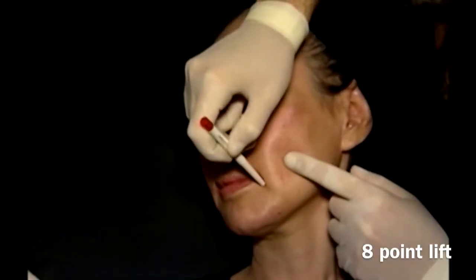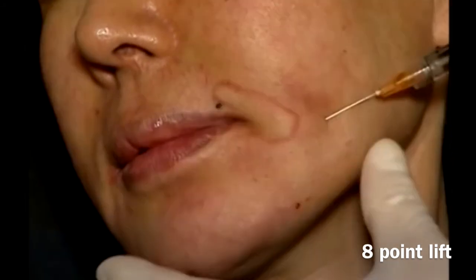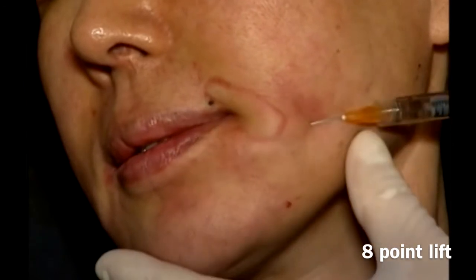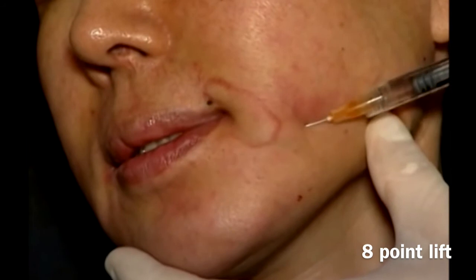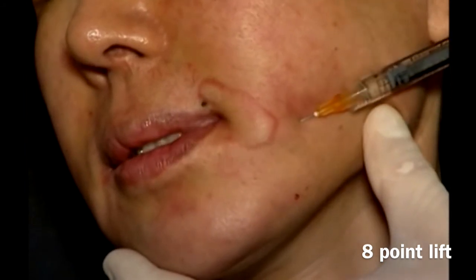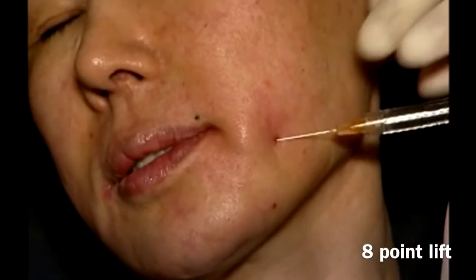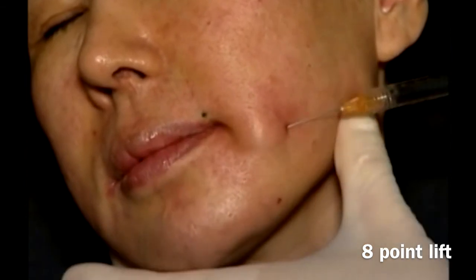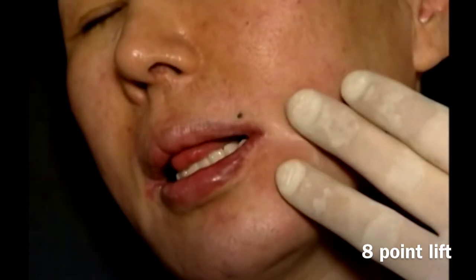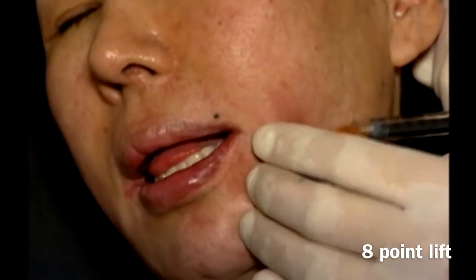Do the very same on the left side. Start by marking the no-go area, inject Voluma with the 25-gauge cannula, retrograde and anterograde to compensate the volume loss and the retruded lower maxilla. By replacing volume at this level, we get a better anterior projection. Change to Juvederm Ultra Plus, because now we are heading to the lower lip. The importance of this strategy is to strengthen the modiolus area, so that there is an improvement and upward lifting of the oral commissure.